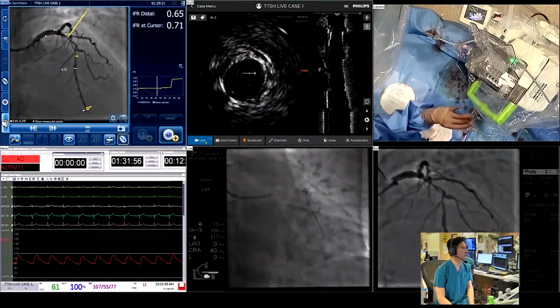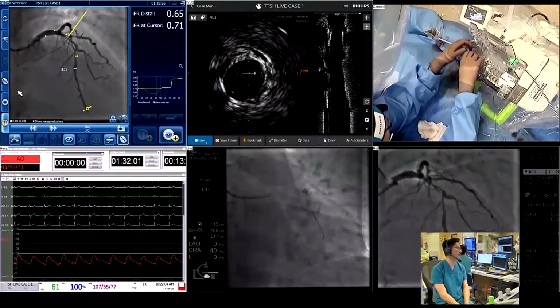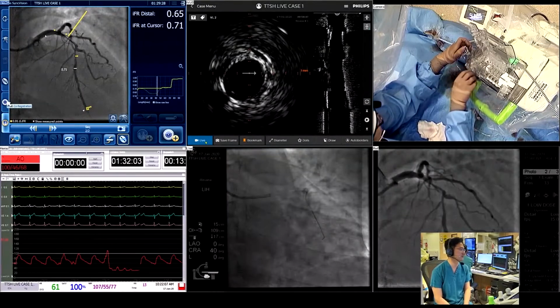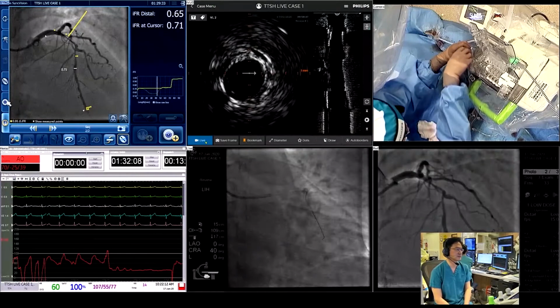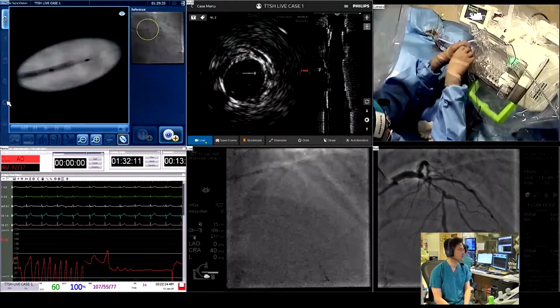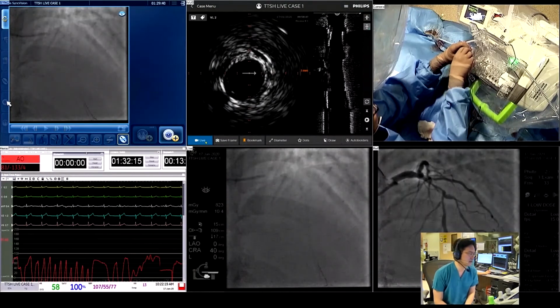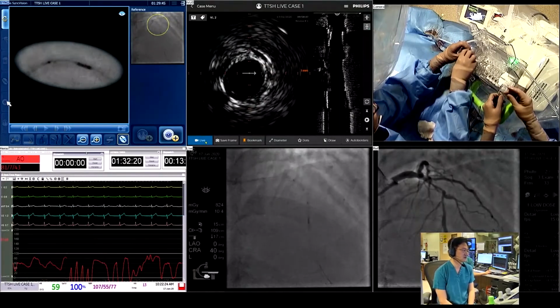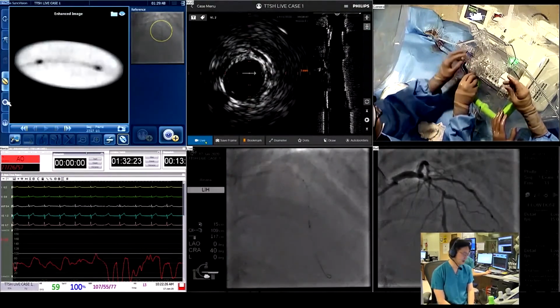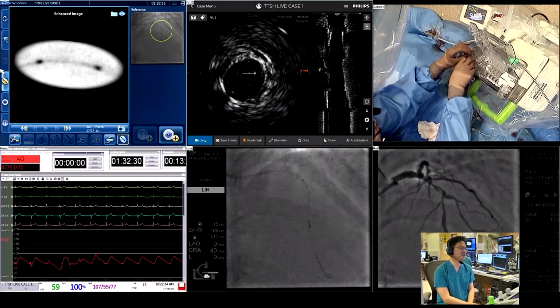Okay, but then we decided, based on IVUS, we actually picked a longer stent and covered beyond the bend to the mid-LAD, beyond the big diagonal. So we already put a stent in, and now we're going to put the IVUS back in to have a look. It's a great artery to assess. Deborah, maybe I will ask you to do the manual pullback, and then we'll do the co-registration, and then maybe you can use the intrasite to do some measurement.